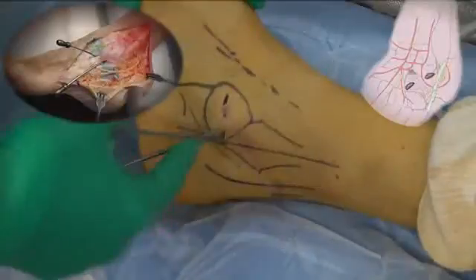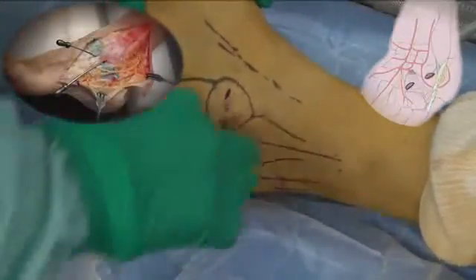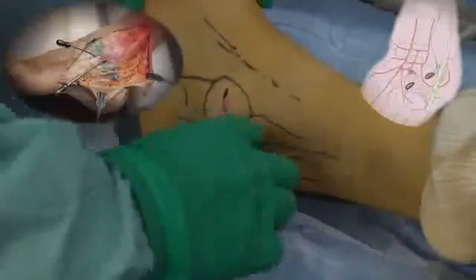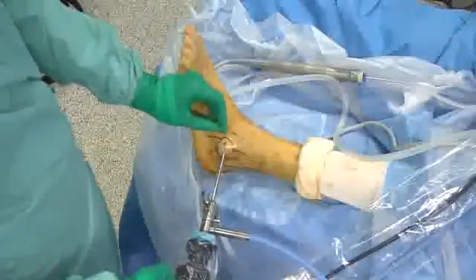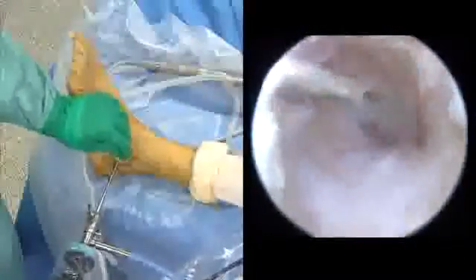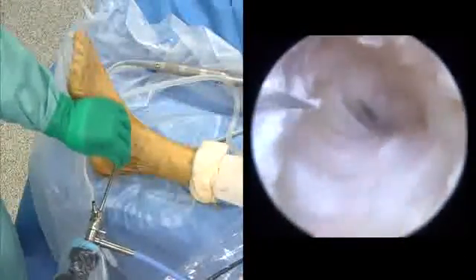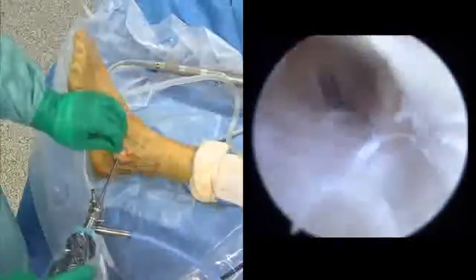The skin is incised superficially and then dissected with a mosquito clamp. The saline solution may be seen oozing out as the clamp progresses. A standard 4.0 mm arthroscopic camera with blunt introducer is first introduced in the middle portal. The camera is inserted and a standard outside-in technique under direct vision is performed for the anterior portal.